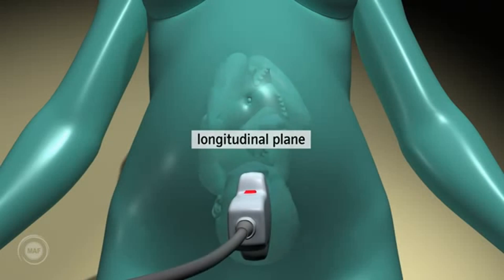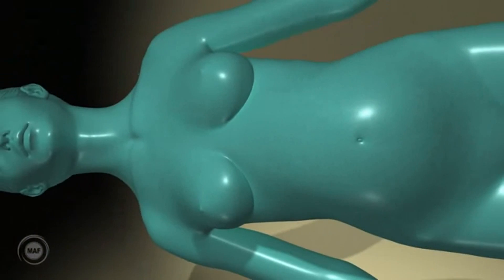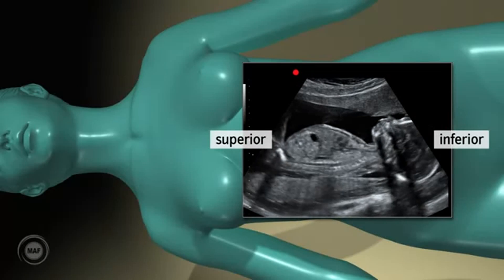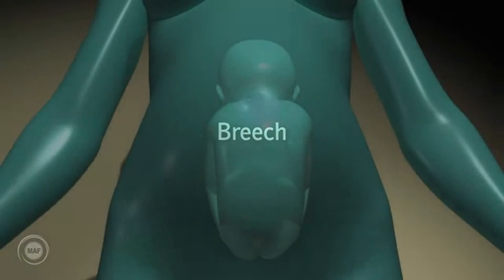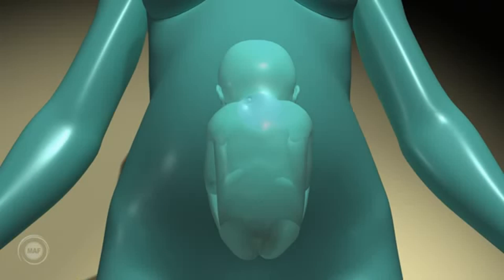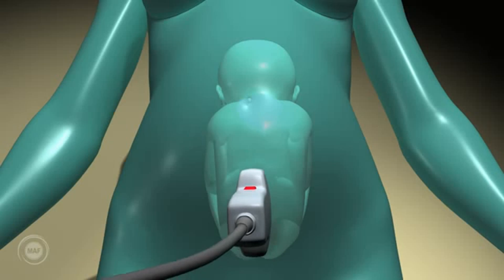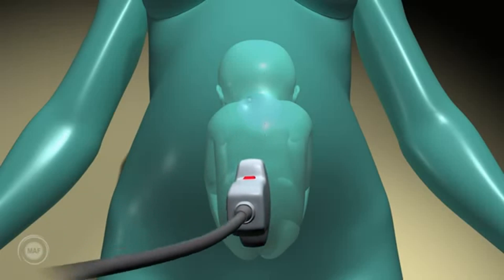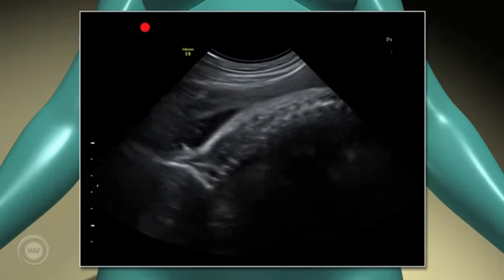To summarise, when scanning in a longitudinal plane, the right side of the screen always shows the inferior part of the mother and the left side of the screen always shows the superior part of the mother. Breech. It is essential to identify a breech presentation before delivery. Regarding the spine position, the same principles apply. For example, back anterior: scanning in the longitudinal plane, the fetus' spine will lie just under the mother's abdominal wall. The head will be to the left and the fetus' back will lie at the top of the screen.